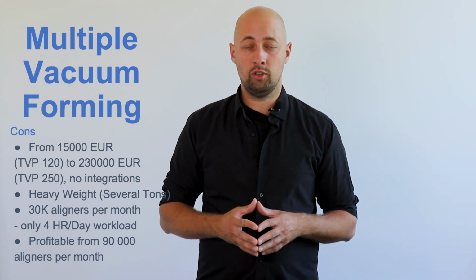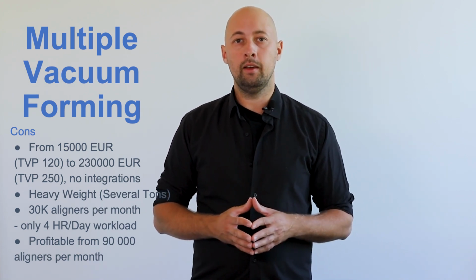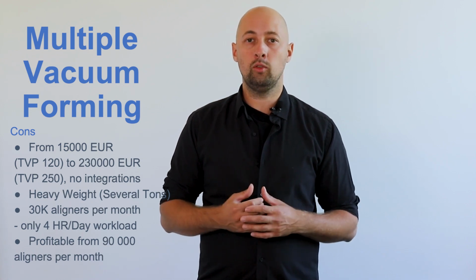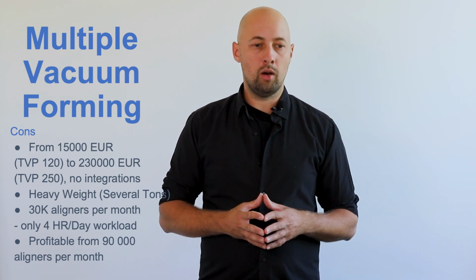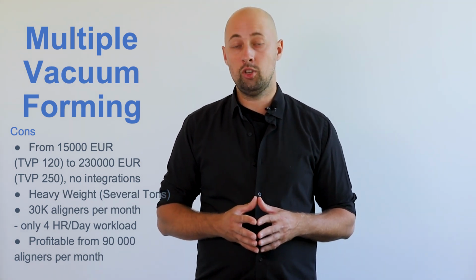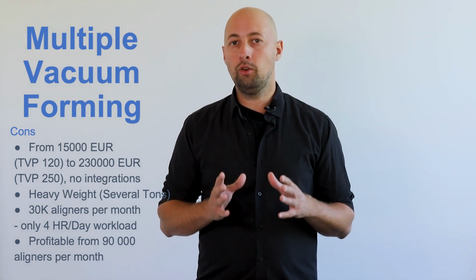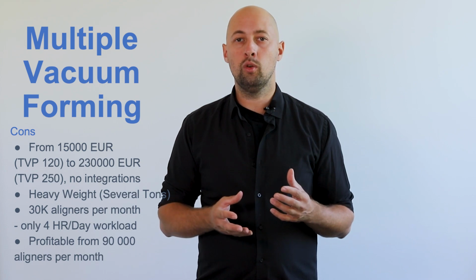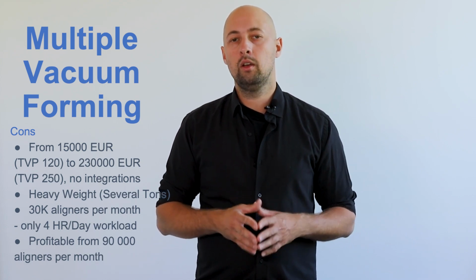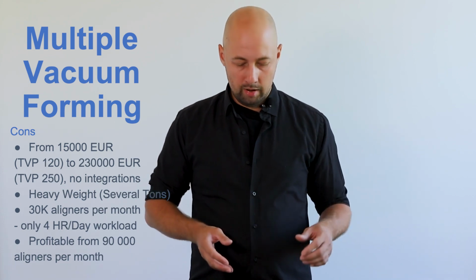And also these machines are heavy, you need some space for them. And in order to get your money back, to make those machines profitable, you need to produce about 90,000 aligners per month, which is a lot. And if you only produce, let's say, 30,000 aligners per month, this equipment will only work for you about 4 hours a day, which is not a great workload for such an expensive equipment.